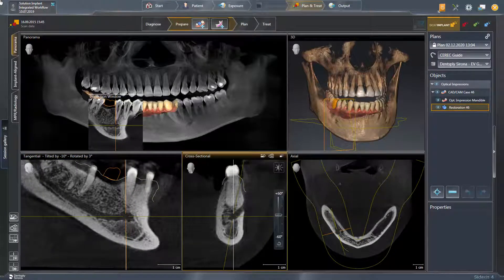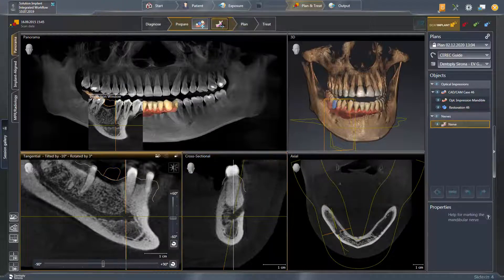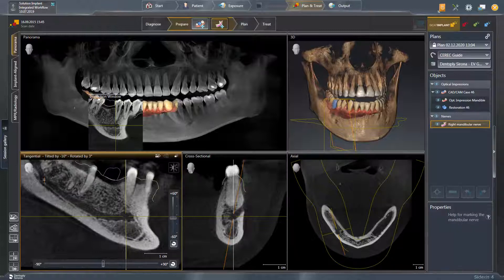Next, we enable the tool Mark the Mandibular Nerve and double-click on the nerve exit to add the first nerve point. We continue with setting further single clicks to define the path.